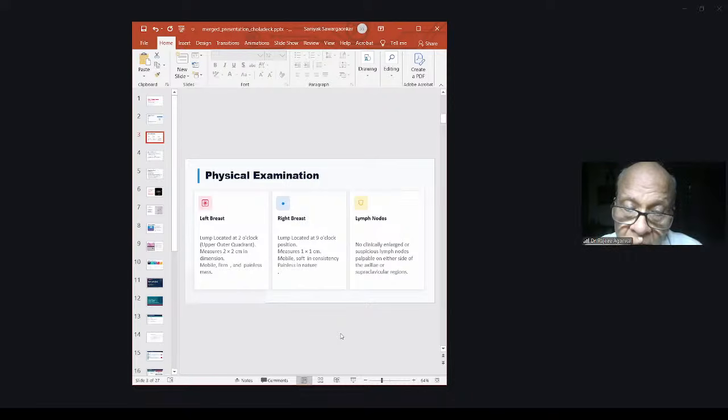Because you don't want to just see the measurement, you want to see what it looks like, how the margins have changed, if the heterogeneity inside has changed. There are a lot of things we see differently, and often with small lesions of 1 centimeter, there may be a second 1 centimeter lesion there which someone may not have seen. So it's very important for the same person to see it, and you have the distance from the nipple and the depth, a lot of other things we need to put in the report if it's going to be followed by someone else. As a radiologist, it's very easy to miss one and find a new one and think that it's the same one that was there before, when it's completely different.